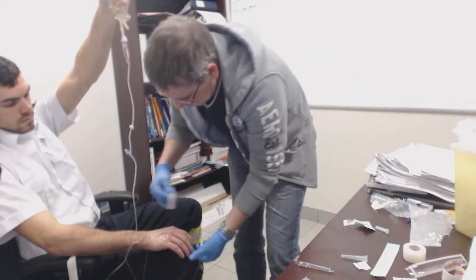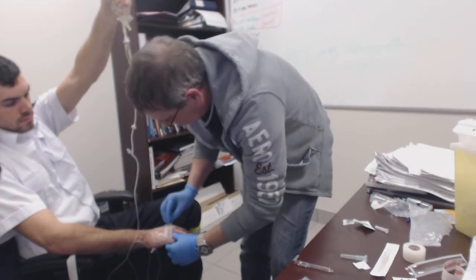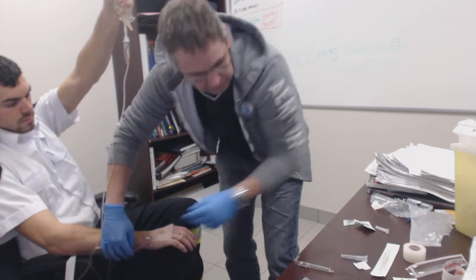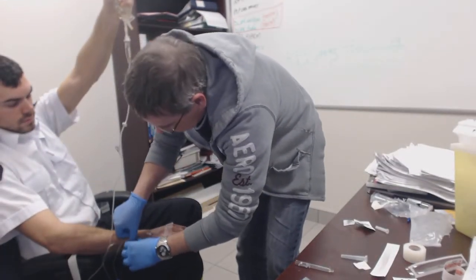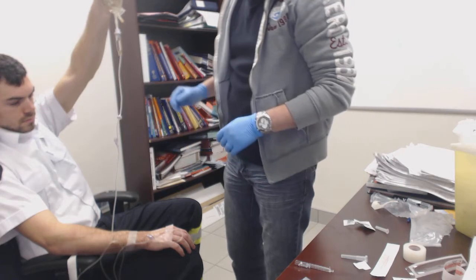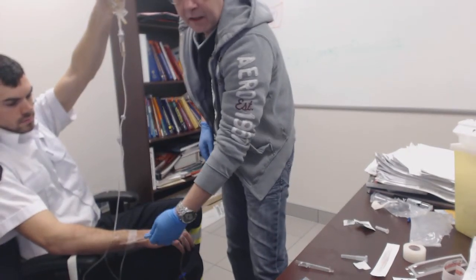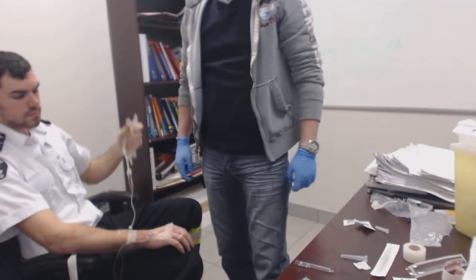And then I'm going to take my tape and tape it on, making sure that I don't put any tape all the way around the limb. And it's nice and secure, so that if he moves his hand, chances are he's not going to pull it in. And I'll shut that off now. There. How to start an IV.